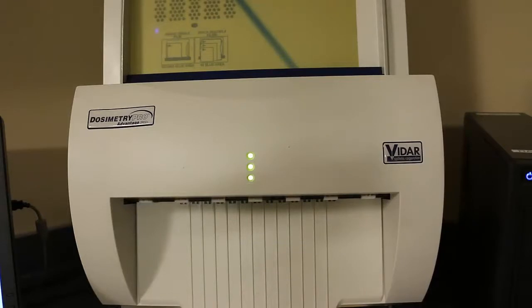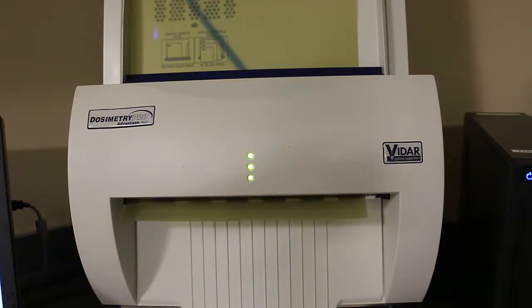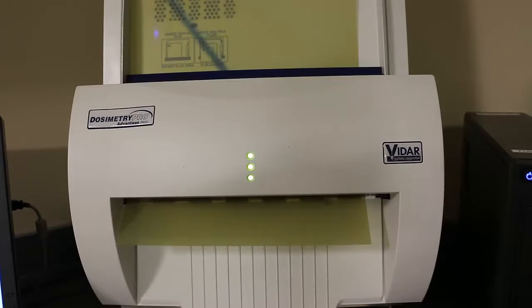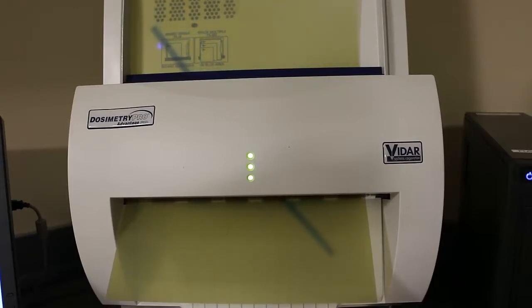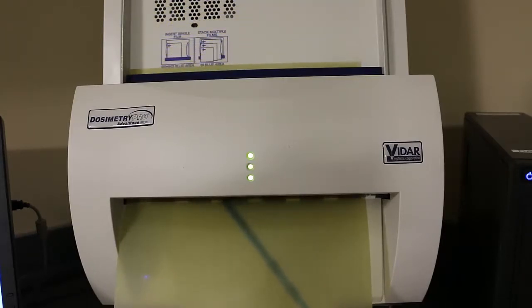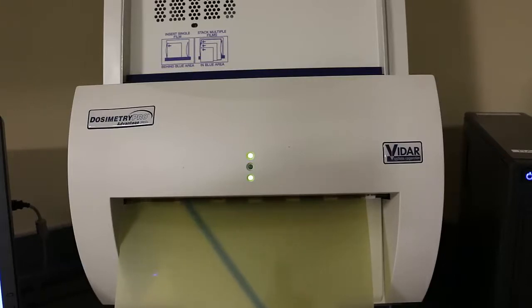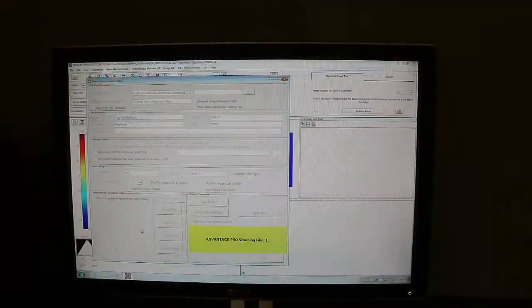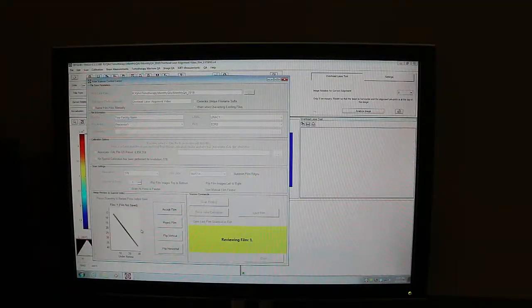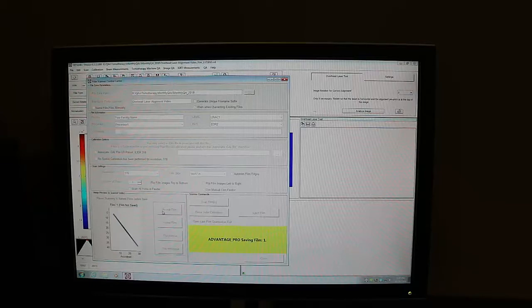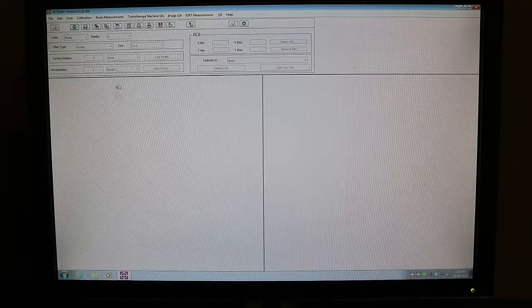When you hit that you will see the film scanner start to pull the film through and back in the RIT software you will see the image of your film pop up. If you're happy with that go ahead and click accept film and close.